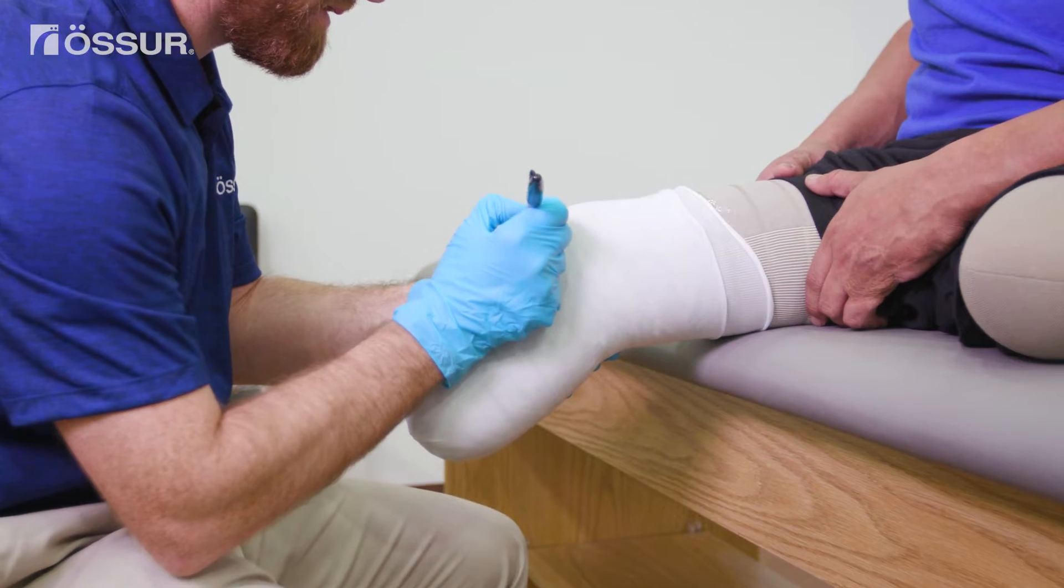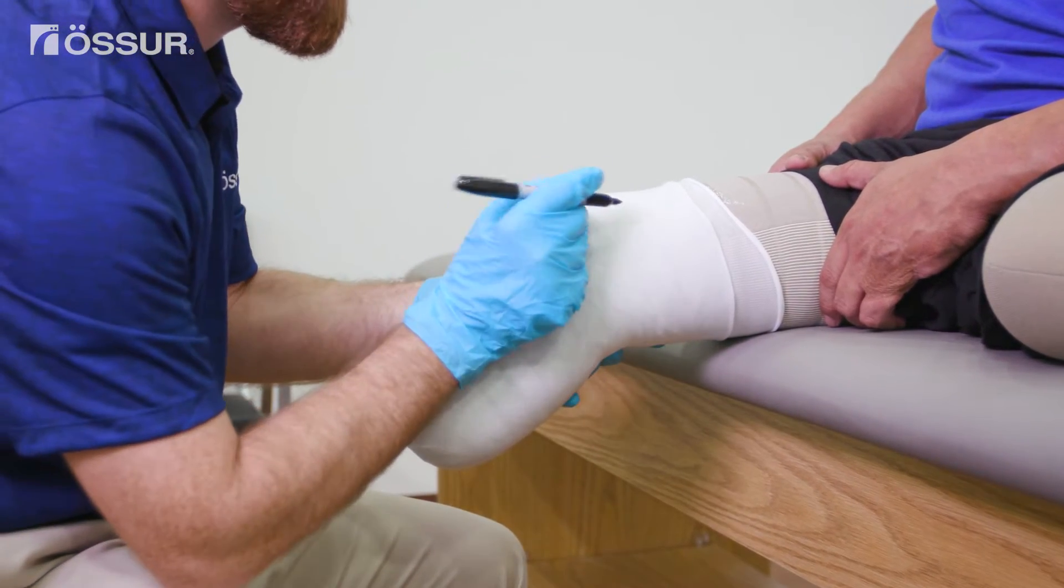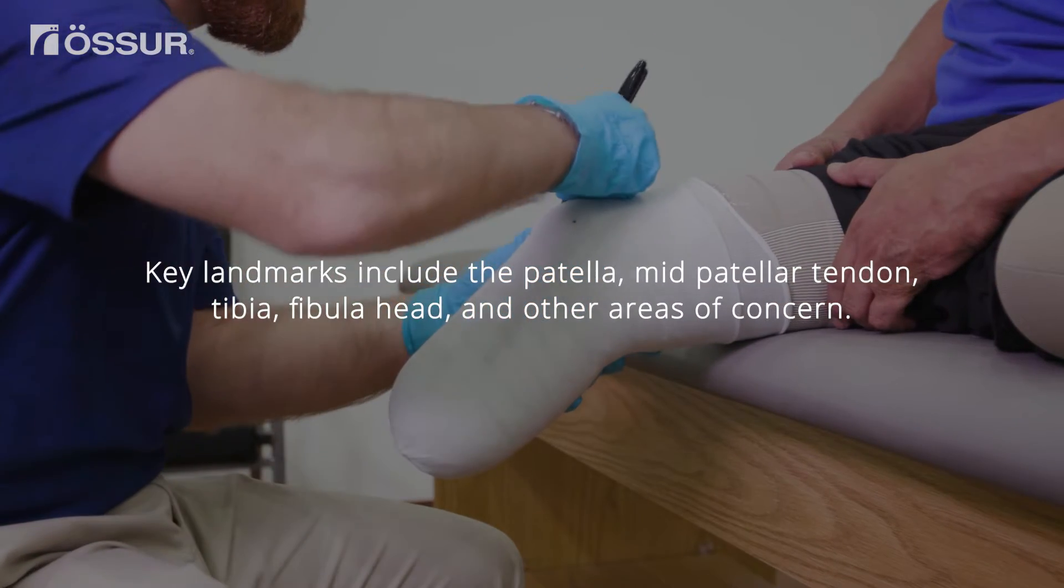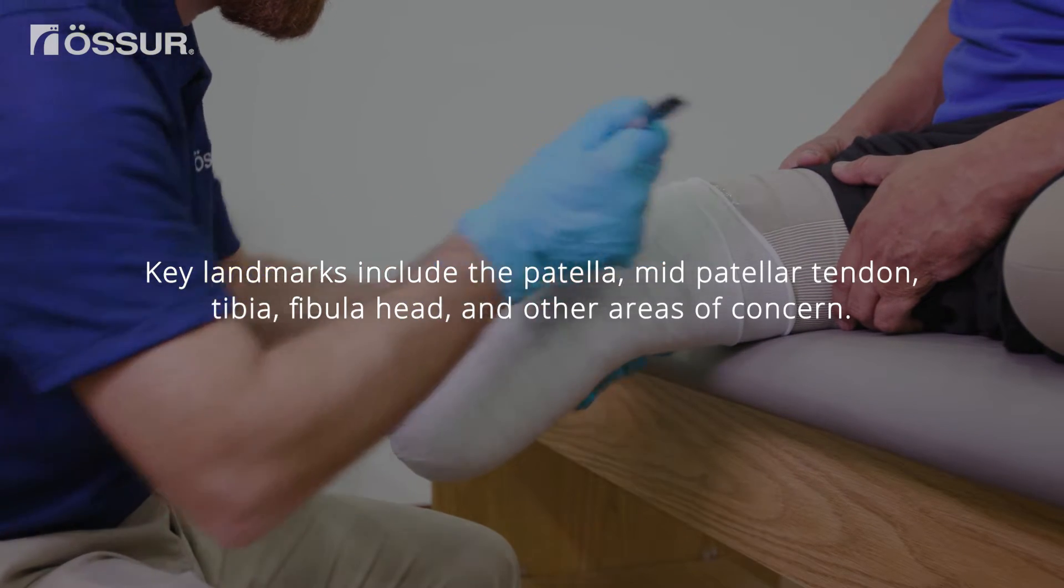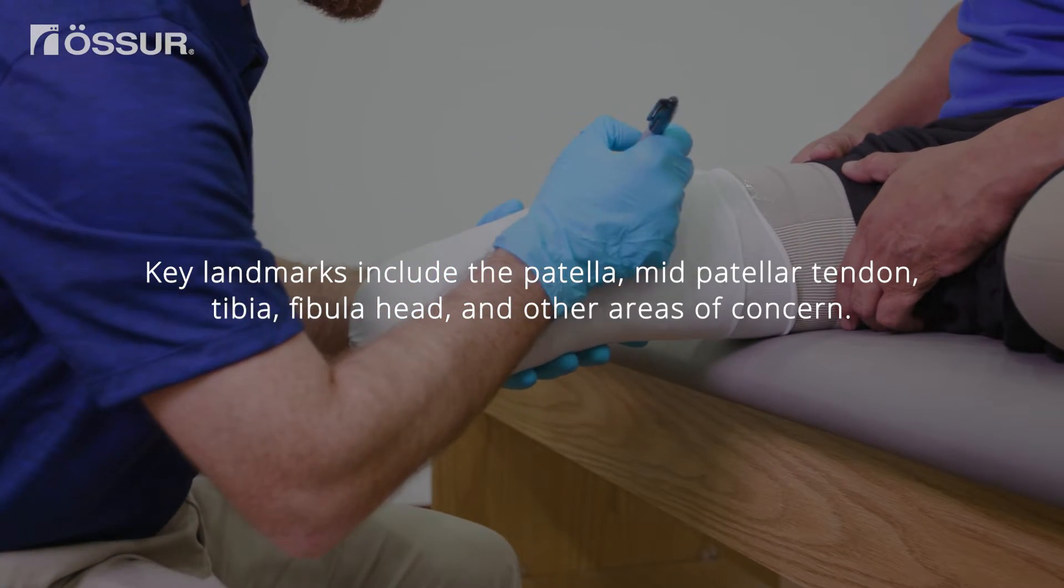Next, identify the key landmarks on the nylon with a marker. Key landmarks include the patella, mid-patellar tendon, tibia, fibula head, and other areas of concern.